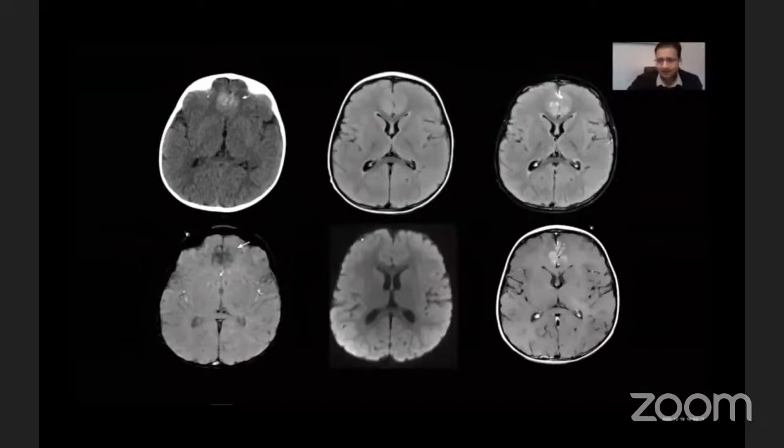And post-contrast FLAIR imaging is a very useful technique, especially for brain tumors. We have this whenever we give contrast within the FLAIR sequence post-contrast, and I would strongly recommend you do that, at least for the brain tumor patient. This is the post-contrast T1-weighted imaging, which again shows this ill-defined enhancement within the cortex and the leptomeninges.